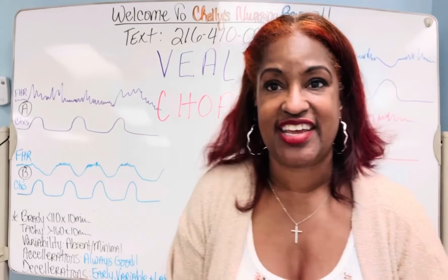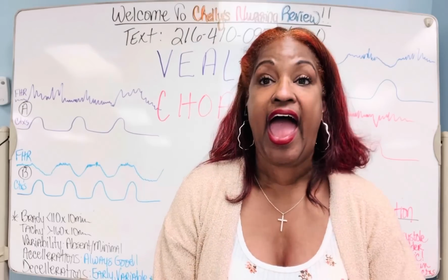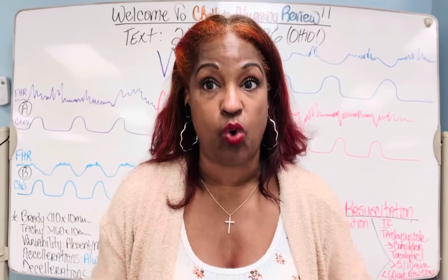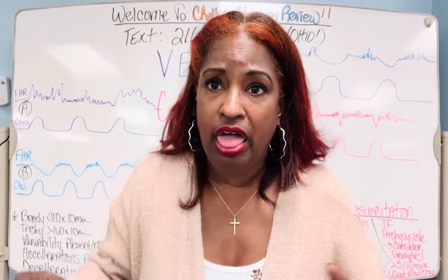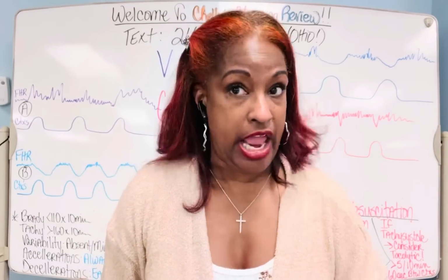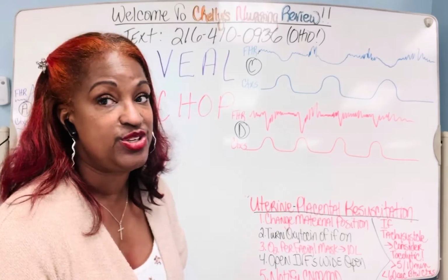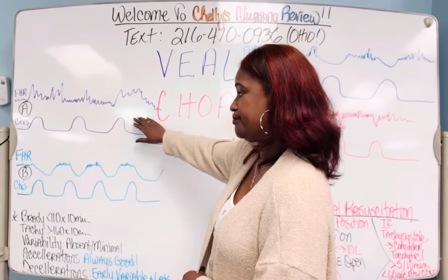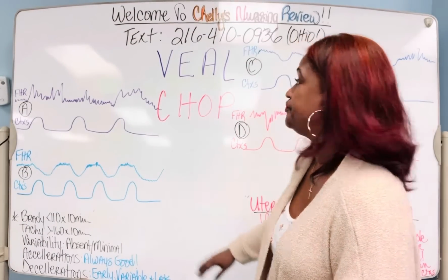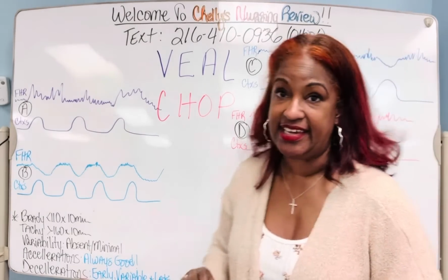The next patient is a gravida 7, para 6. And she's coming in telling you her water broke in the car, and she's huffing and puffing, going and blowing. It's coming, and you better get ready because this baby is on its way. Which monitor strip do you think she's going to have? Would it be strip number A, strip number B, strip number C, or strip number D?